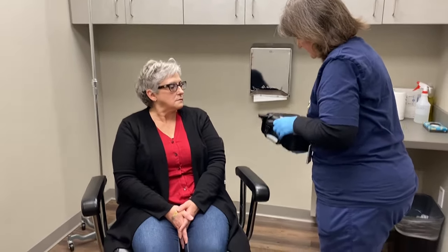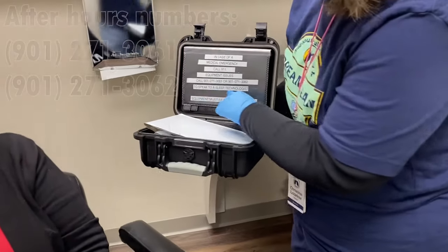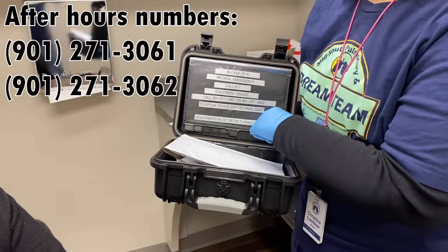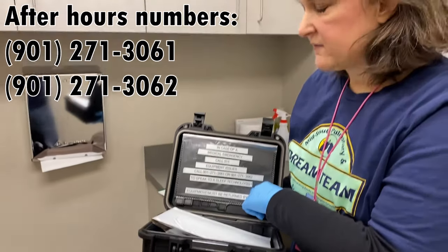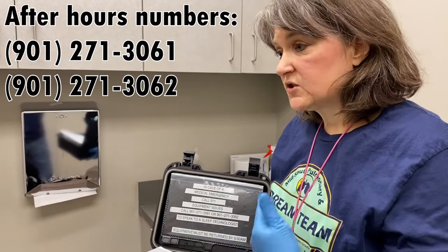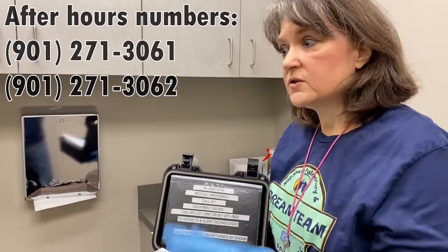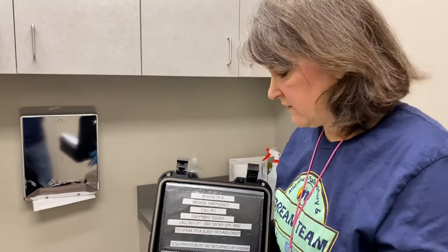You'll just flip up on these latches. In the lid there are a couple of numbers that you can call. If you get home and you've forgotten something I've told you, or you think of a question you forgot to ask, we have technologists available to you who can usually answer your question over the phone.